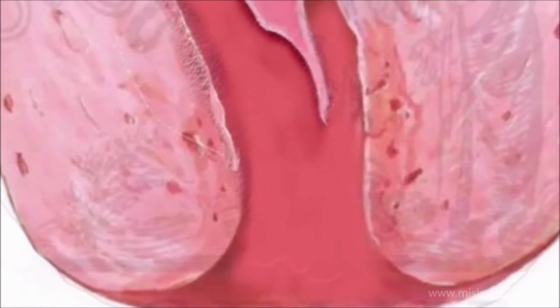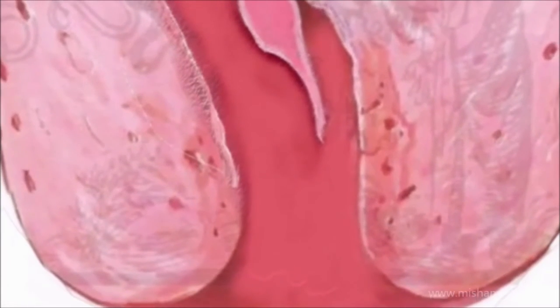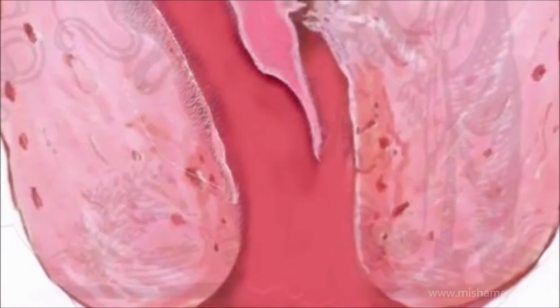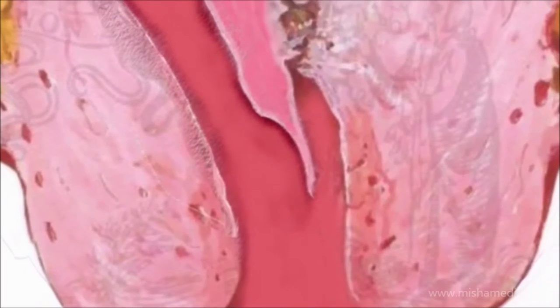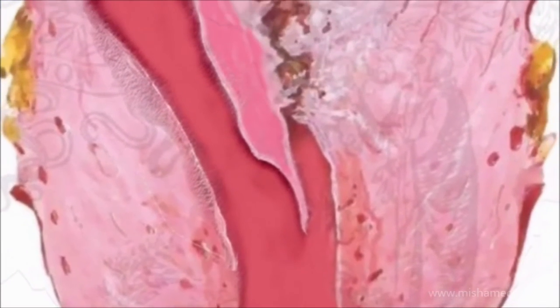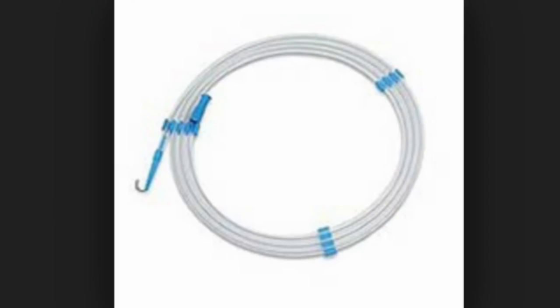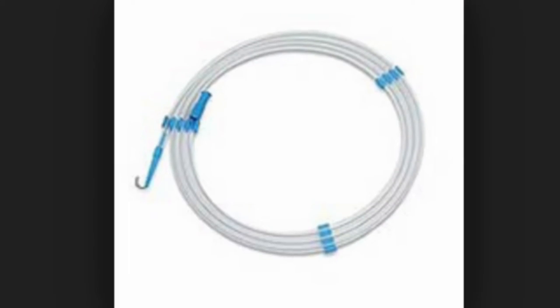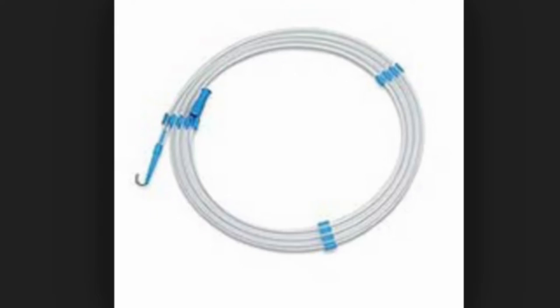The case presented shows how a false passage created while performing an endocervical curettage is overcome using a guide wire and vessel dilator. These tools are contained in any central line kit and are readily available in any operating room.